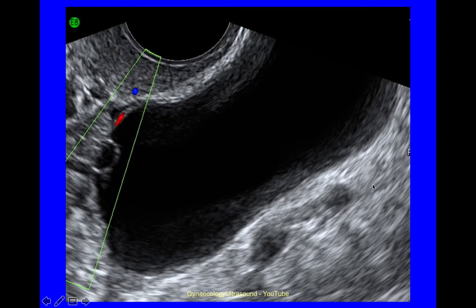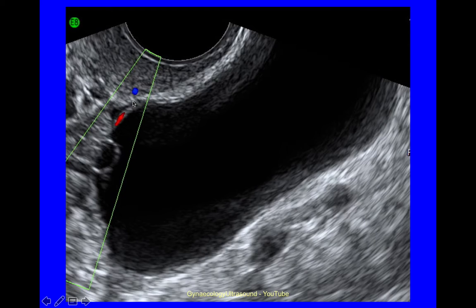This cyst is multilocular — one main locule with another small locule. No solid material, minor vascularity, and no shadowing. It's important when you put colour Doppler on that you have the sensitivity set correctly, a PRF of 0.6 reducing to 0.3, adjusting the sensitivity. There will be another video specifically about this.